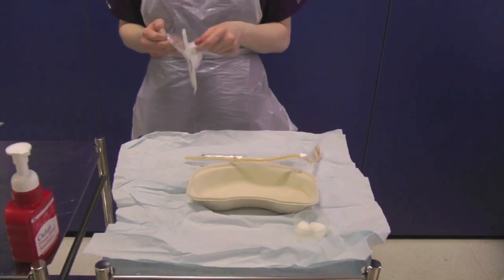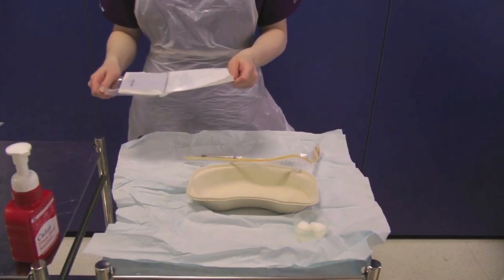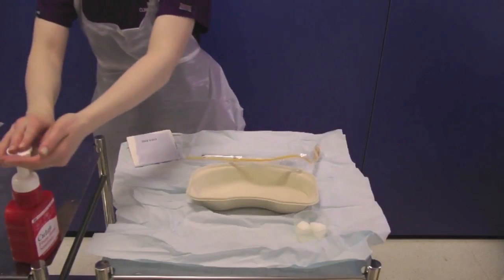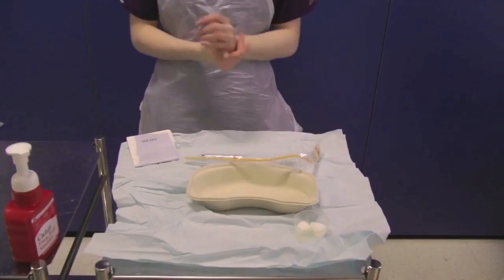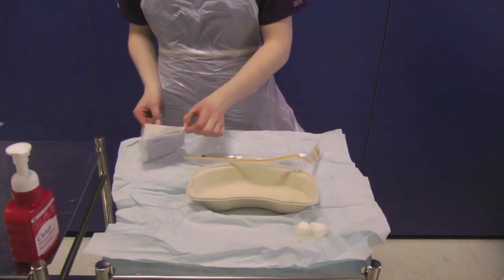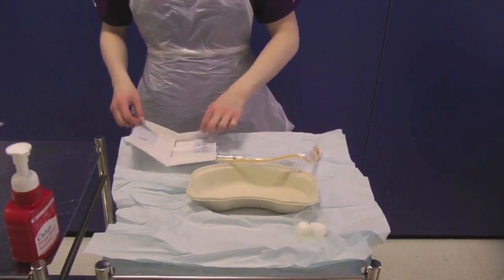Open the outer packaging of a pair of sterile gloves and drop the internal packet onto the sterile field. You must now decontaminate your hands. Carefully open the sterile wrapping, ensuring you do not touch the sterile field, and put the gloves on.